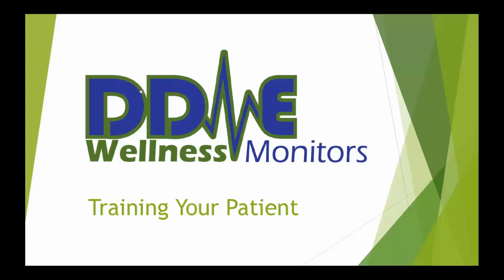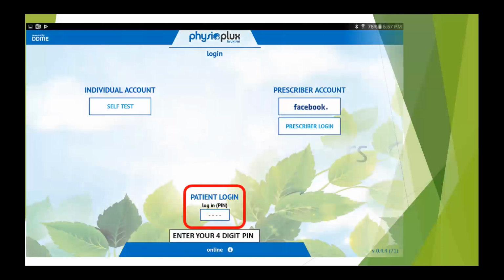So I recommend calling the device the wellness monitor. Say something to the effect, we're going to send this device home. It's going to measure the quality of your sleep on a variety of parameters, and we're just going to see what's going on when you're asleep. You might want to put in a little more benign detail than that if you'd like, but don't overwhelm your patient with information about sleep apnea and so on and so forth. Okay, this is just a recommendation.